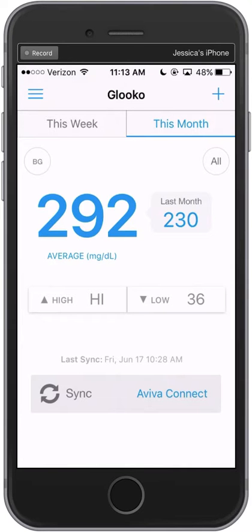Hey there! Welcome to Glooko! Did you know that Glooko integrates with many fitness and activity trackers to incorporate exercise data alongside your blood glucose readings? We've found that this can be helpful for understanding how diet and exercise affect diabetes data. Today I'd like to show you how to configure your supported fitness or activity tracker with Glooko.